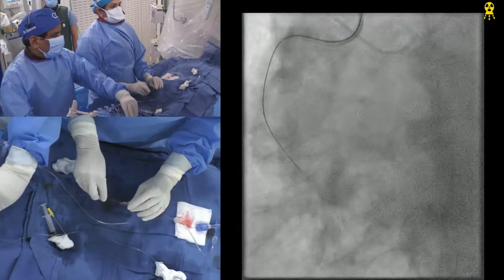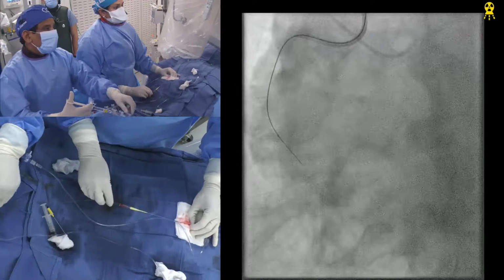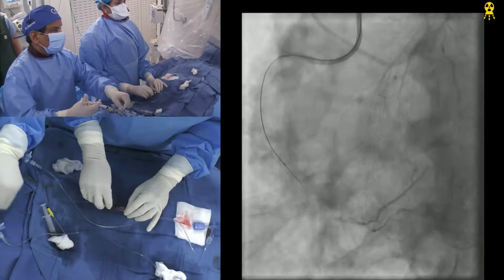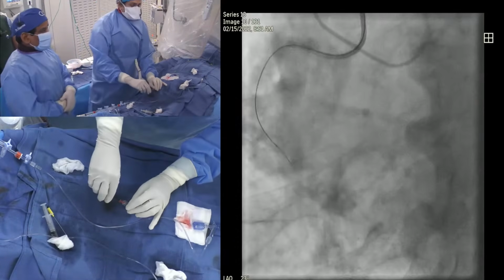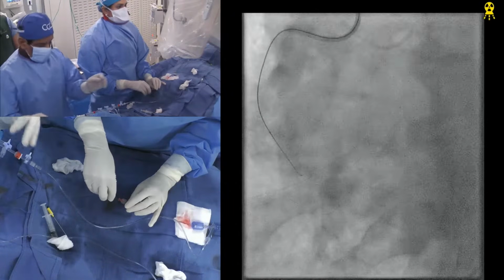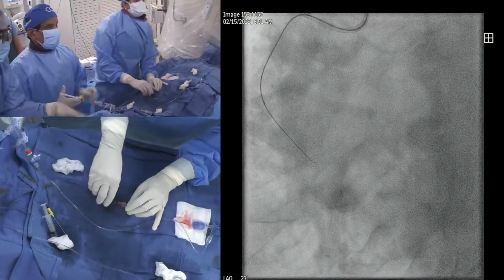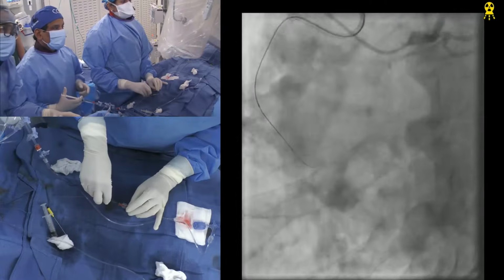Do you want to take a cine? Then only you'll see. It's very intriguing where it is. The wire is moving very freely at the distal tip. Not sure, probably subintimal. You have to go antegrade also a little bit. You have to inject both, complete dual injections, because the bridging collateral is also doing it. I'll do retrograde first. You do antegrade first.